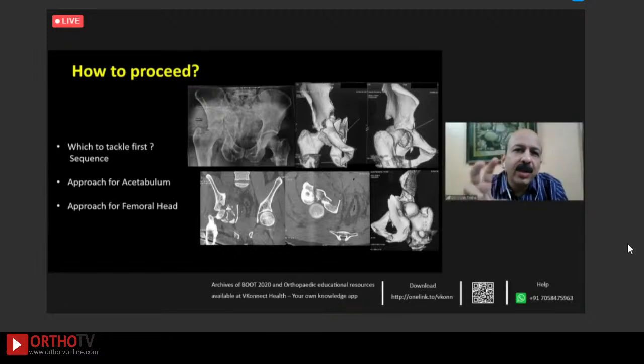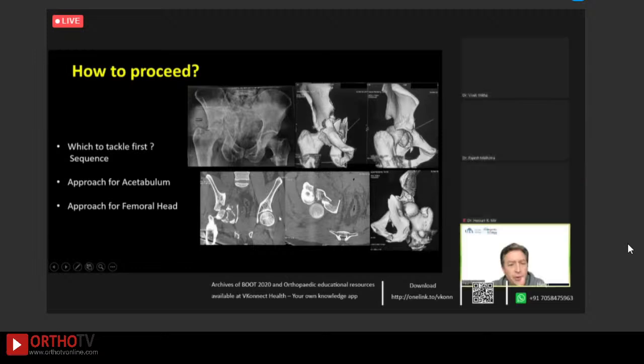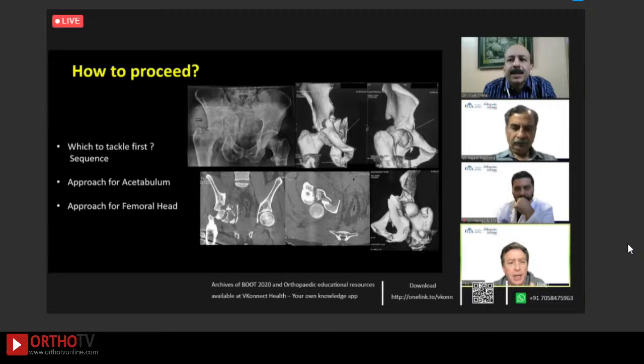Because if you see that the posterior column is broken and is widely displaced out there, even if you are doing a surgical dislocation beforehand, where exactly is it going to stabilize? We are not able to see anything out there, and your reduction as such, and stability pattern, is also difficult. Right. And you can clip the posterior column right through the Kocher portion of your surgical dislocation before you do your capsulotomy or dislocation. Yeah, exactly.